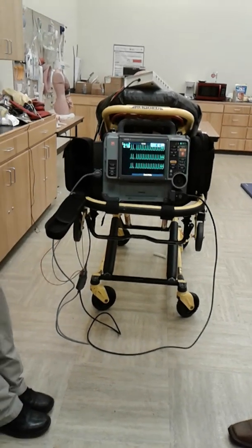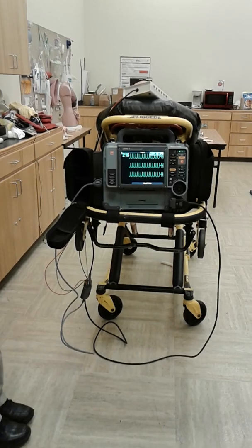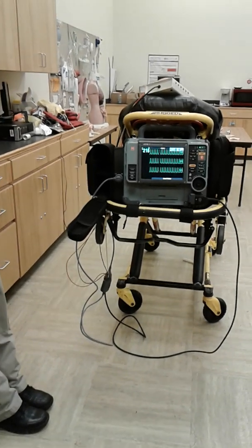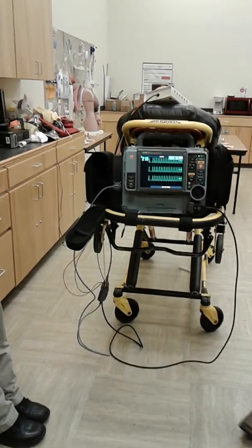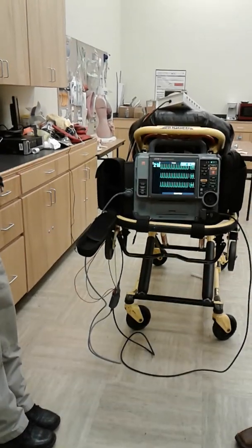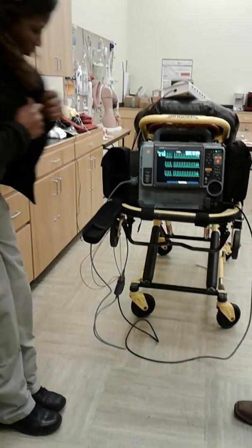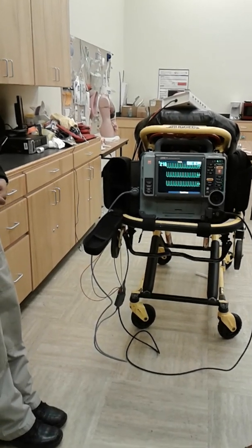Okay. All right. So we got a sinus tach, rate of 216. Well, we know that most sinus tachs don't exceed more than about what? 160. Again, depends on what literature you read. 160, 150. Okay. If you're having a hard time determining, look at your patient. Let that patient be your deciding factor on what type of rhythm we're in. All right, so we're going to obviously say 216 is above whatever literature we read.